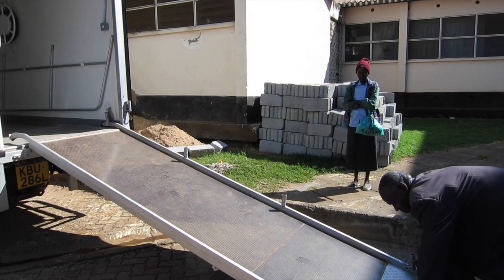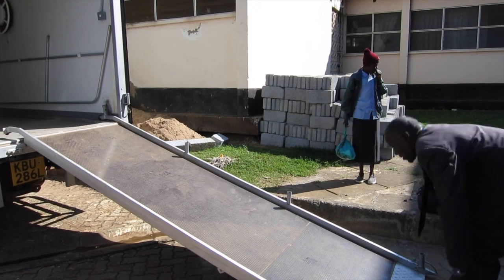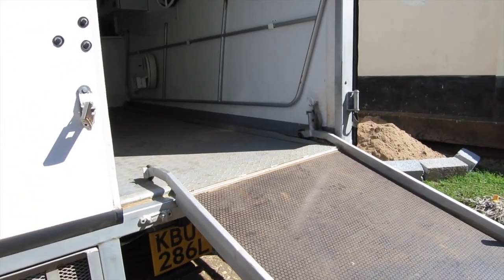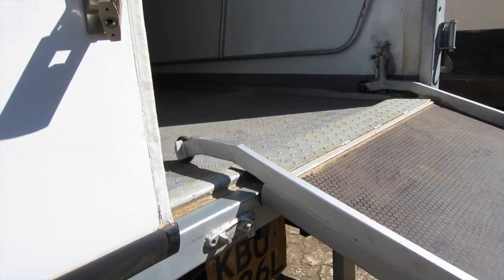In this example, the left side of the ramp catches against the truck and needs to be repositioned. Now the ramp is positioned appropriately.